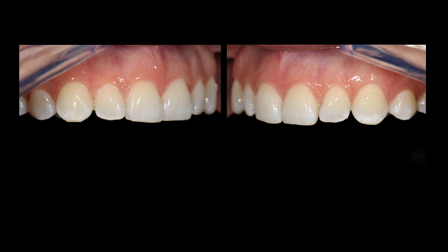You can see the highlights on the line angles. I basically use exposure compensation to fine-tune my exposure. I find I'm using aperture priority for my exposure mode, and then I fine-tune it with either the exposure compensation on the flash or on the camera. You can do this with any camera system, whether Canon or Nikon. I'm just adjusting to get the histogram in the correct place. I try to keep my images around f22 or f25 rather than going to really high f-stops, as image quality decreases at very high f-stops.